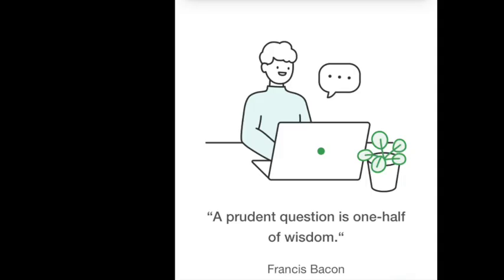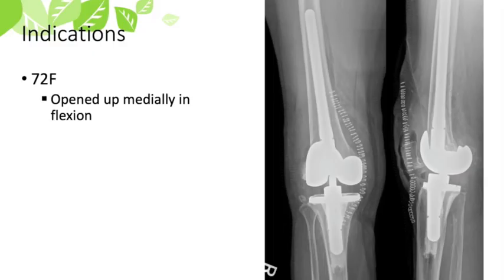I agree, very little. I think knees want a stable medial side to function well, and in some of the cases I've unfortunately been a part of where there's been damage to the ligaments intraop, the medial collateral ligament, it's usually not a fixable problem. Usually the injury is at the level of the joint, sort of right through the MCL, not really at the origin or attachment. And so in those cases, you have to increase the constraint.